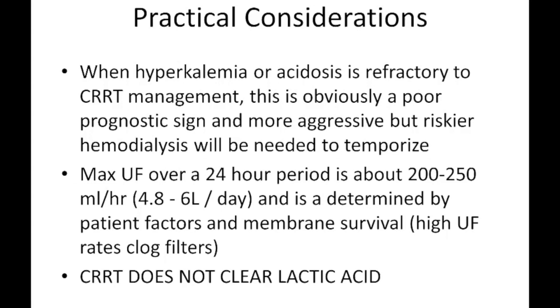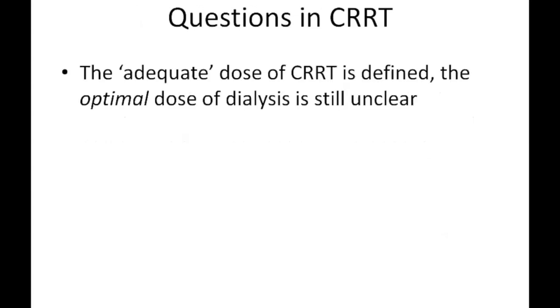One thing that's also out there is people ask for CRRT in the setting of poor perfusion or other types of lactic acidosis. And CRRT does not have the ability to clear lactic acid in a meaningful way. The clearance of it is something like 3%. And so correcting the underlying problem is the answer to lactic acidosis.